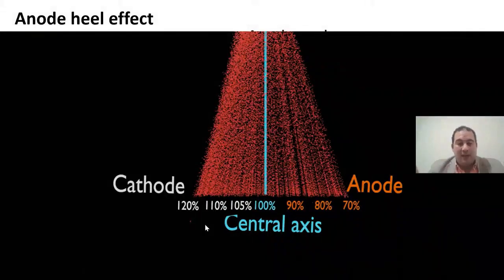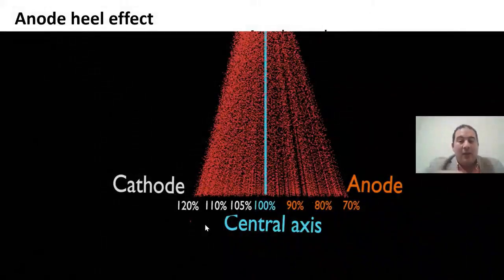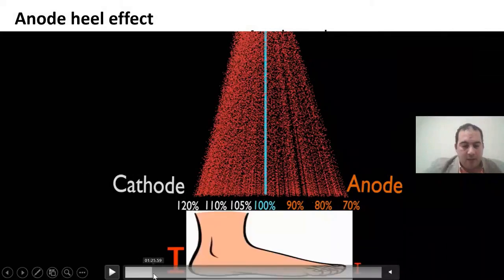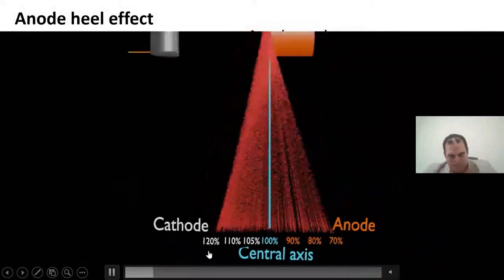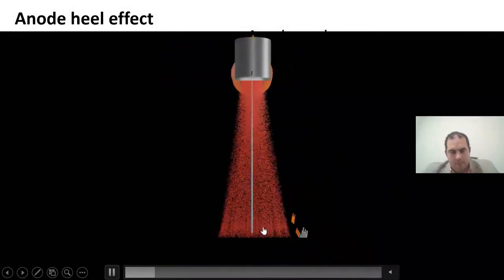Therefore, my angulation of the X-ray tube primarily relies on utilizing the anode heel effect to ensure that the image produced is homogeneous. If I do not take this variation or the angulation of the X-ray tube into account, it will give us a non-homogeneous image. Let's see. We will refer to it here as the anode heel effect, of course, because here is the shape of the beam.